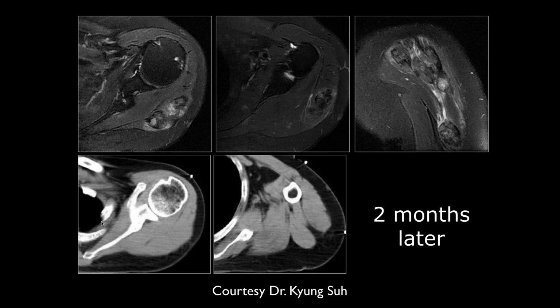And this is 2 months later. It looks like that got bigger from what we had. It's more nodular, maybe has some hemorrhage and necrosis, and maybe some bone formation given those decreased signals. But on the CT, it doesn't show calcification, so I'm guessing this is all hemorrhage and necrosis.